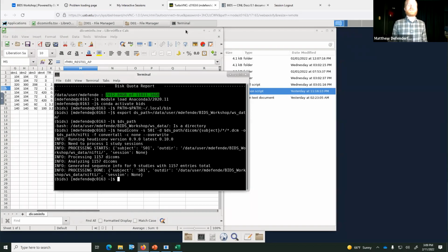What might be easier to do is to just convert all of the scans in full, and then later on go through and edit the NIfTI files that you have to remove the volumes that you want to remove. So I would still use the matching criteria with the number of volumes that you have in the full sequence, and then do your sequence editing after conversion.